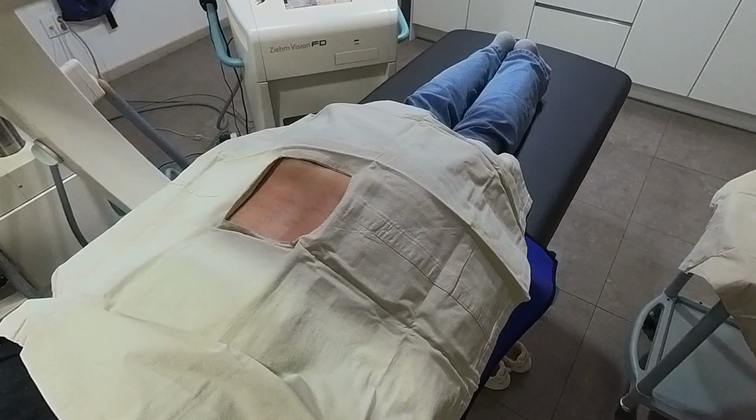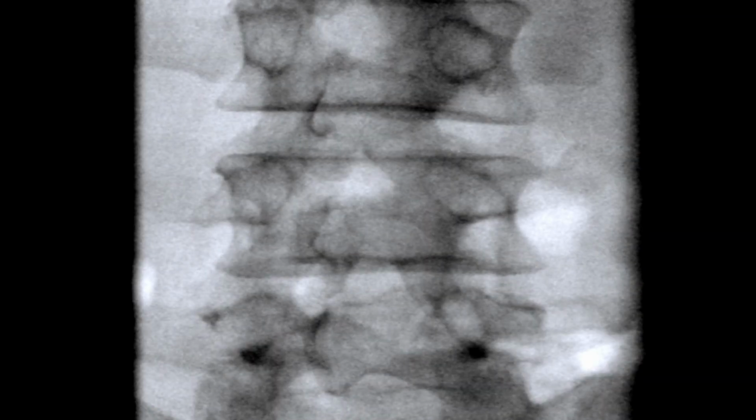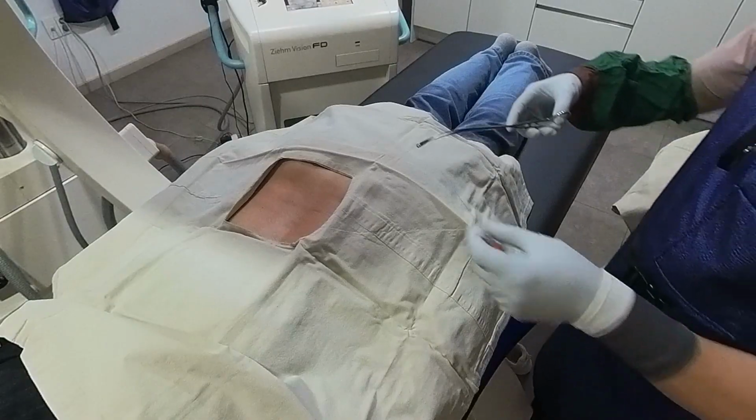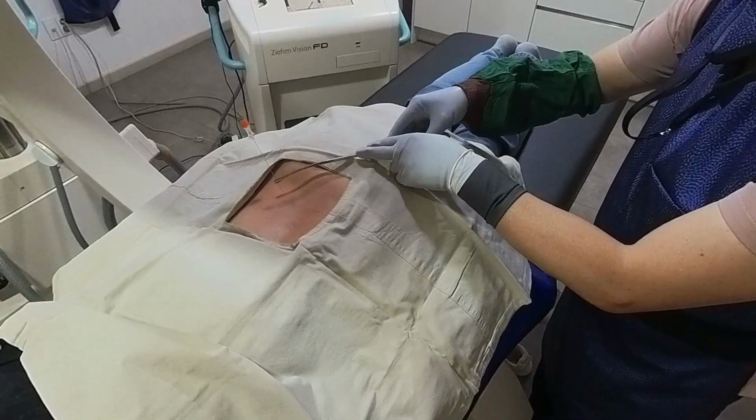Even though the L3-4 annular tear is the primary cause of the discogenic pain in this case, I decided also to target the L4-5 annulus to be thorough. So, the first step is aiming for the right L4 infraneural approach.